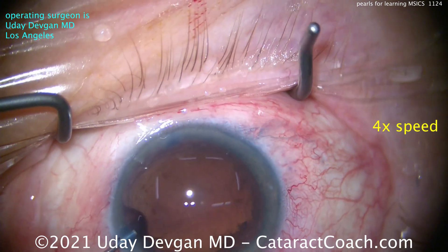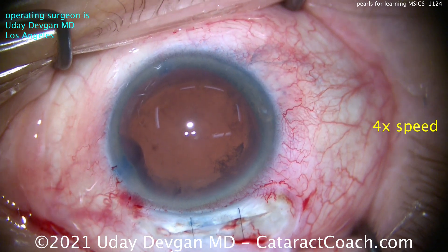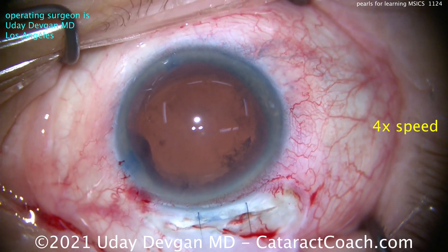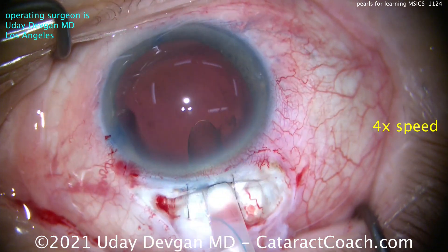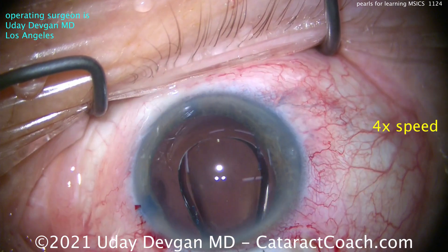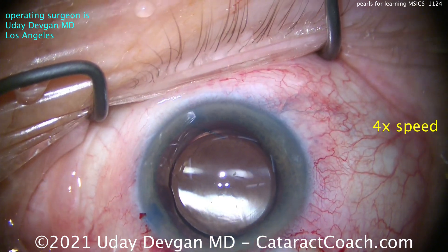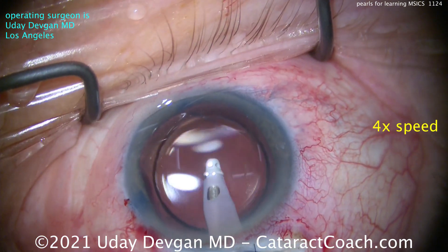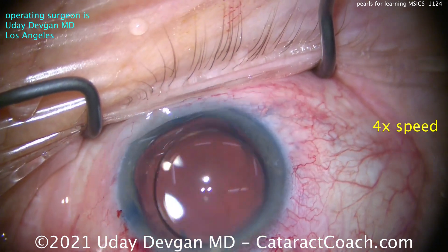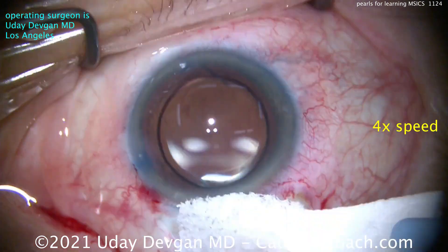To put the new lens in, we're using a three-piece acrylic lens with a monofocal optic — a negative three diopter lens for a post-op outcome of minus one in this very myopic eye. We deliver the lens into the capsular bag, and you can see there's a nice overlap of the rhexis — about five to five and a half millimeters. Now we can seal up the incisions.